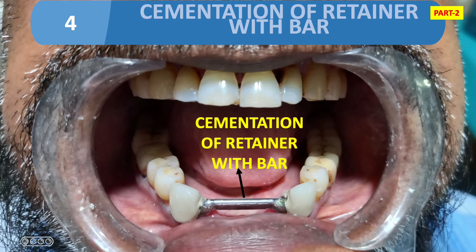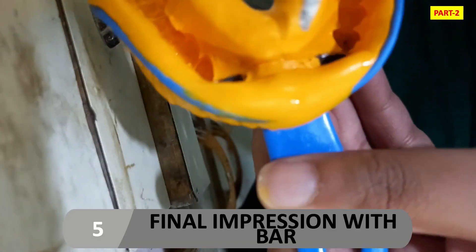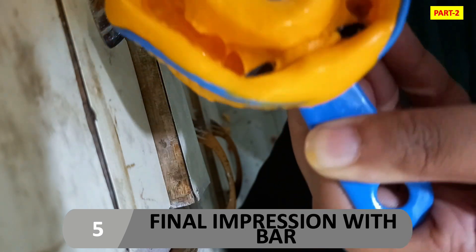Then cementation of the retainer with bar is done. As you can see in the figure, we cement the retainer along with the bar. Here you have a choice: either make a second final impression with the retainer in place, or first cement the retainer and then make the final impression — it is up to you.